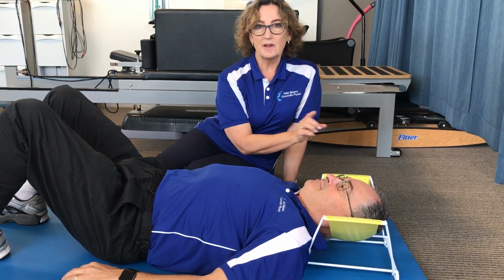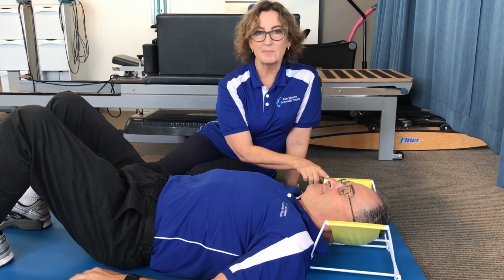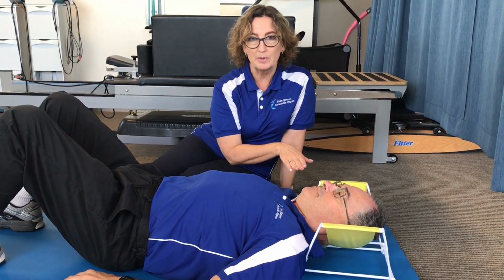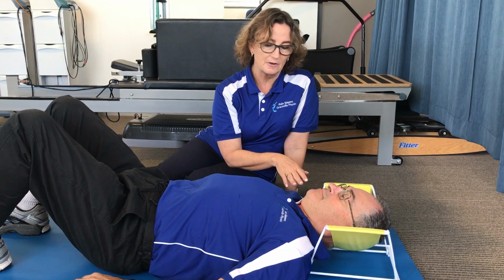Otherwise, if you're too sensitive, then this may not work, and you might not have a Neck Tek, so you can do it without it. Just put a little pillow there if you can't lie flat on the floor.